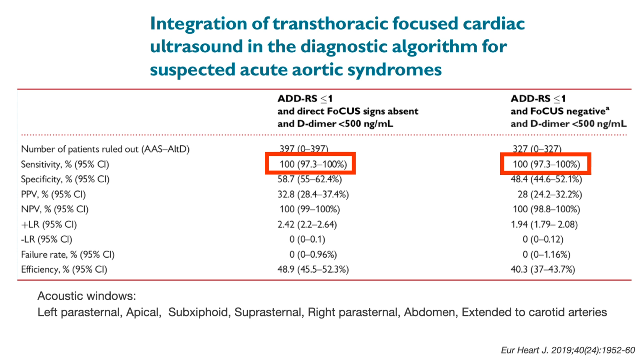Their protocol included parasternal long, parasternal short. They did subxiphoid, they did abdominal views and iliac views, and they got carotid view. This protocol took some time, and in the emergency department, this may not be something we can do effectively, quickly, and then also have high quality, sensitivity, and specificity.